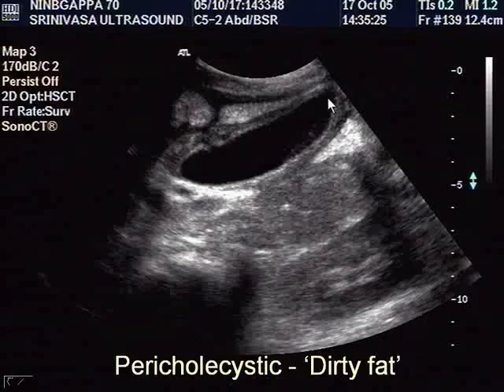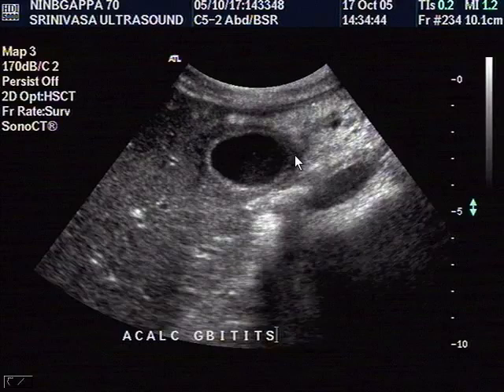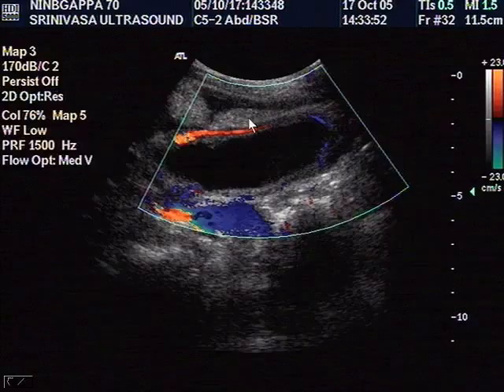Now this is a gallbladder. There's no stone at all. But when I look at the peritoneum around, there is water logging, there is edema of the planes all around, and that tells me, yes, that is infiltrated, edematous peritoneum and fat. So therefore, that tells me that this gallbladder is pathological. And when you do a color Doppler, you have vascularity all the way around.